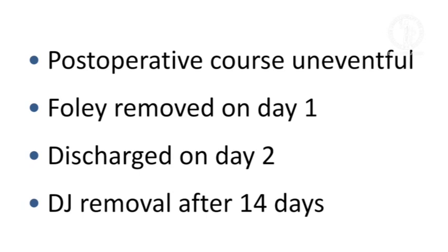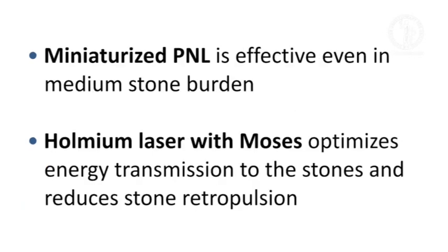In summary, we demonstrate the excellent efficacy and safety of our mini-PNL technique and the use of a high-power holmium laser with Moses mode.